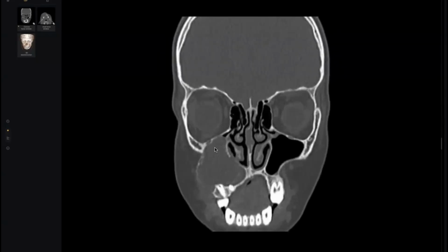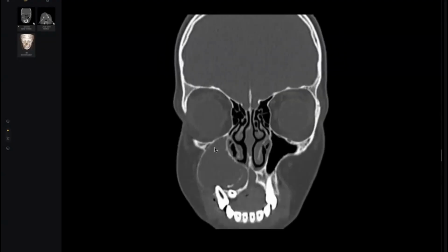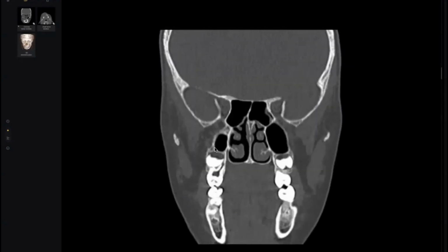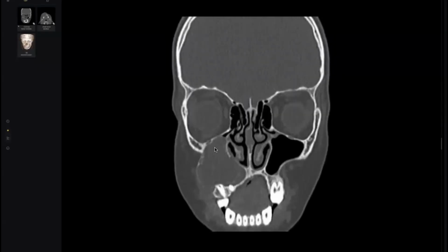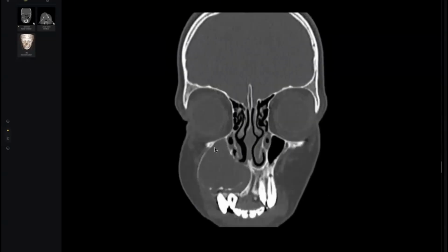This is a case of a maxillary odontogenic keratocyst. The doctor differentiated it from adamantinoma, as she said, and then from the dentigerous cyst, and even from a maxillary mucocele. In my opinion, my colleagues, try to persuade the examiner and tell him your differentials and exclude them automatically. Don't let him ask you. Automatically, doctor, I will exclude number one because of 1, 2, 3; number two because of this; and my most expected differential diagnosis is this. Okay, management 1, 2, 3. Like this, the examiner will be so impressed.